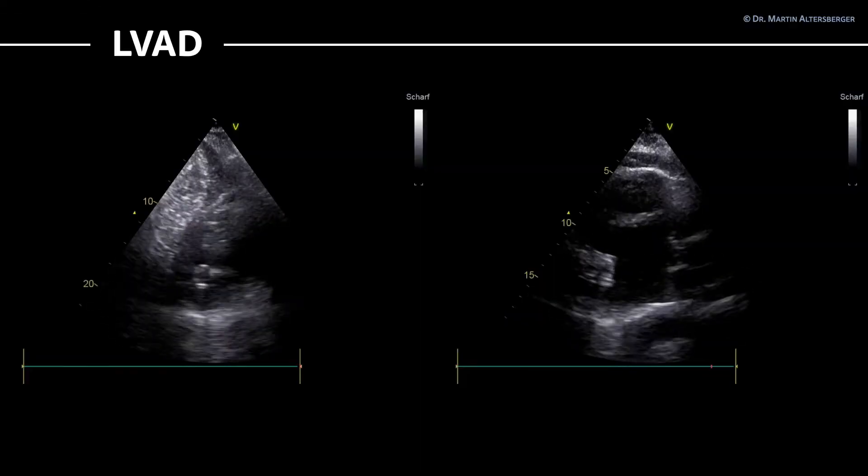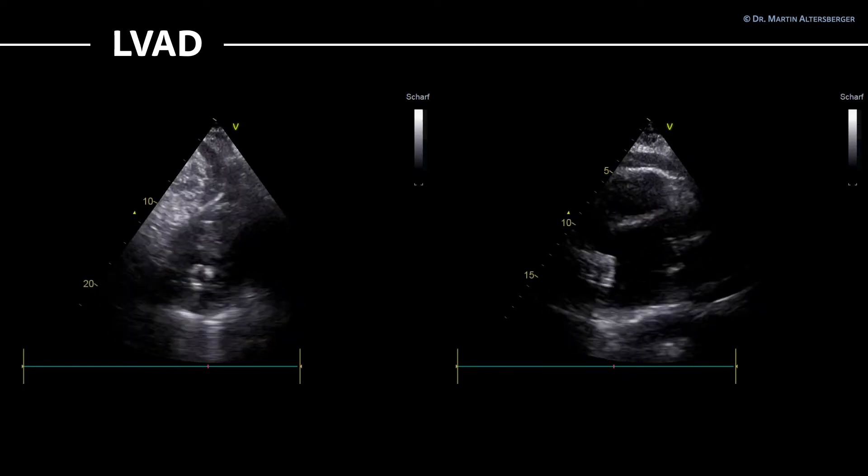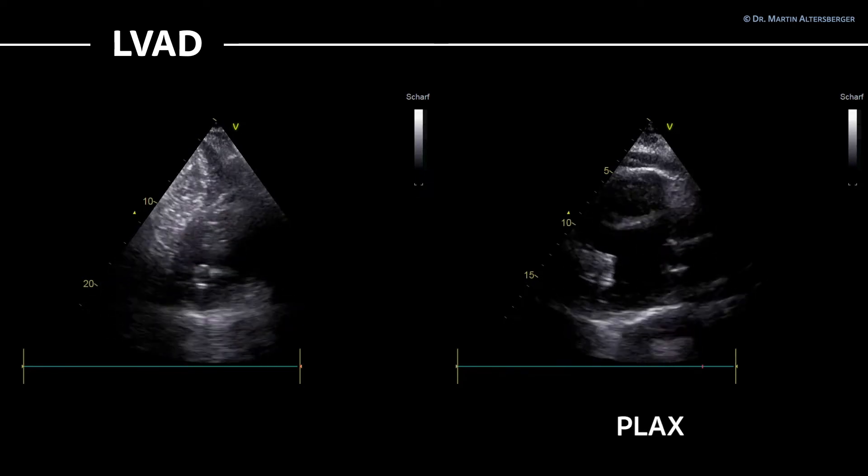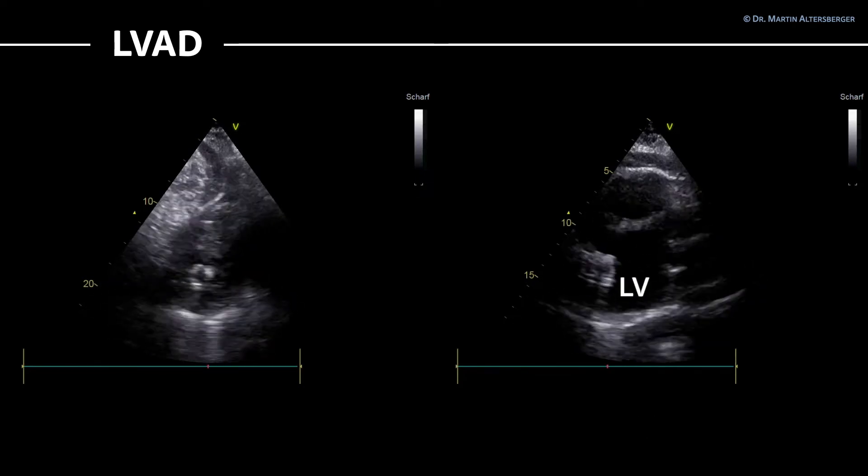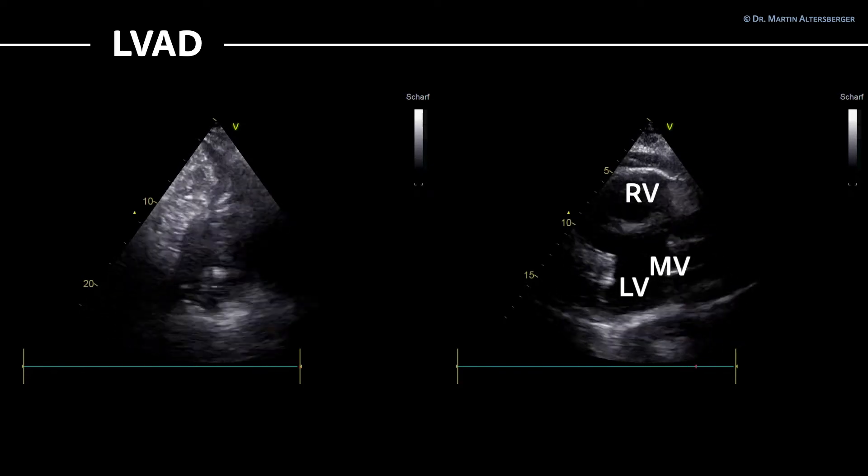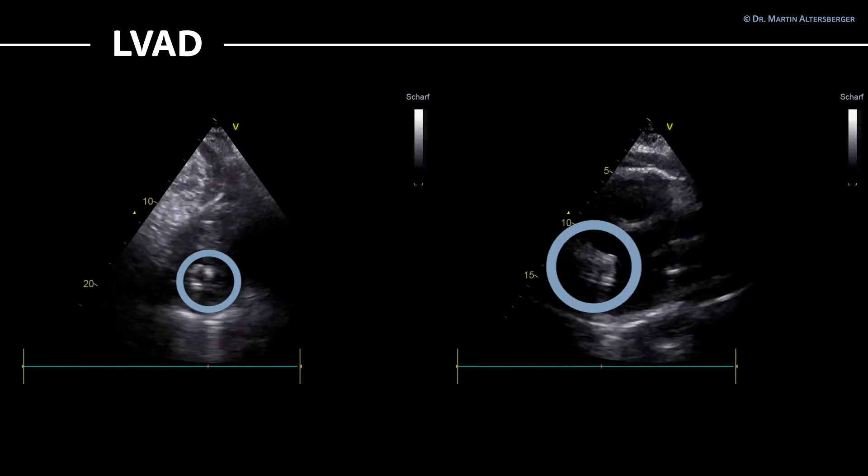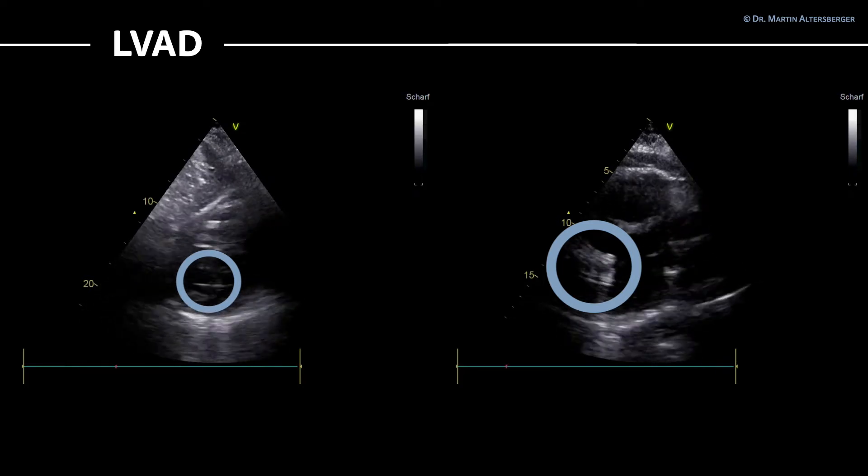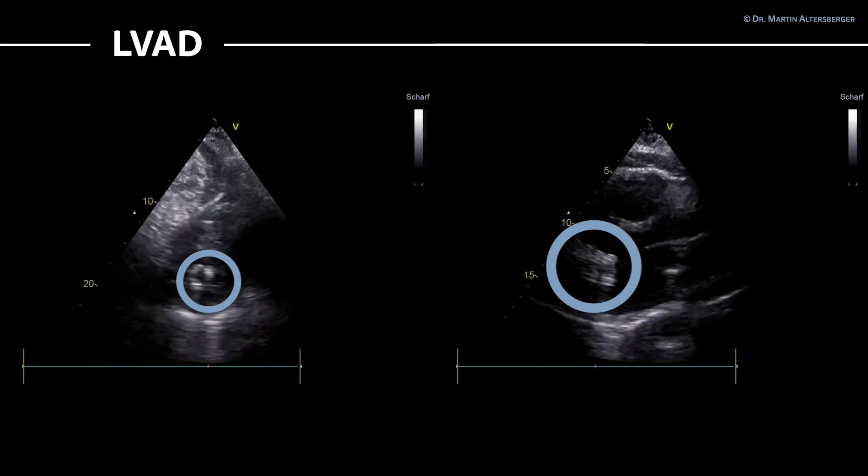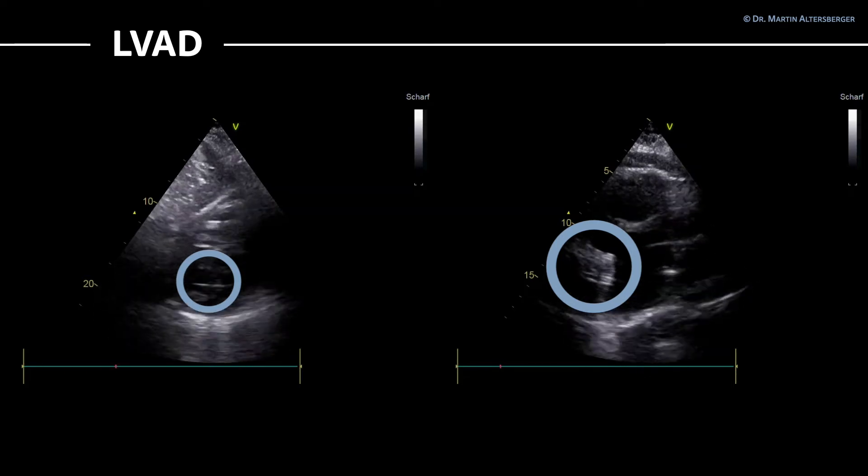In this specific view, you see that there is a structure in the center of the heart which doesn't belong there. On the right-hand side, you have the same patient in a parasternal long axis view. You can see the left ventricle, the mitral valve, the right ventricle, and in the center of the left ventricle, there is this assist device. So be aware that with a left ventricular assist device, you cannot measure diastolic dysfunction.